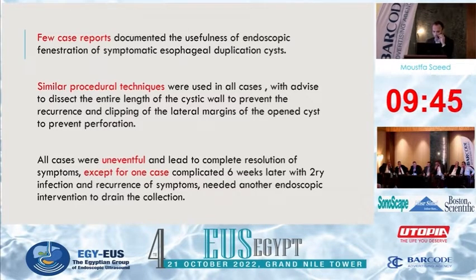All cases were uneventful and led to complete resolution of the symptoms, except one case which was complicated 6 weeks later with secondary infection and recurrence of the symptoms, and needed another endoscopic intervention to drain the collection.